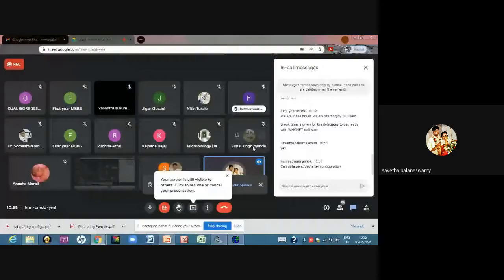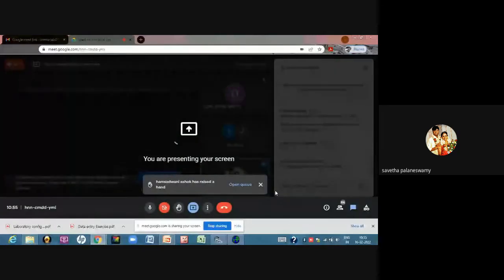Okay. I think we'll start with our demonstration. First, just observe how I am doing it. Then we will give half an hour's time. Then you do the exercise we already started. You just try with that exercise. Okay. So just observe what I am doing. I will share my screen. If there is any interruption in my presentation, kindly put it in the chat box.